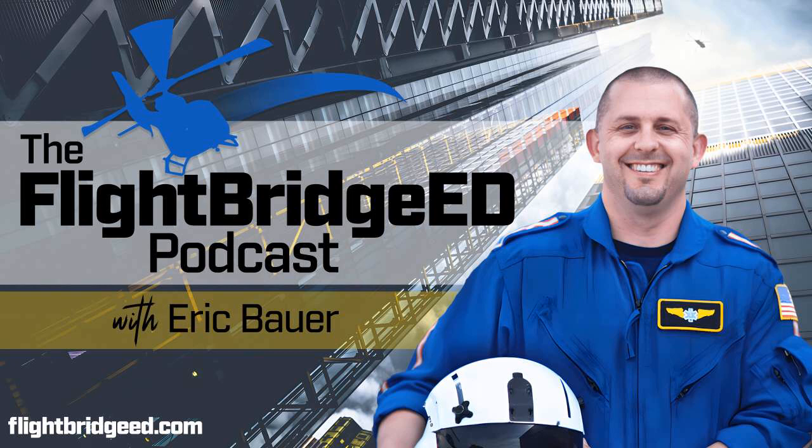So that's always something you document, right? That is what we kind of consider now as your true systolic blood pressure. Because out of any phase now, whether we're talking about your assisted systolic or your assisted aortic end diastolic pressure, or we're talking about your diastolic augmentation, that is now truly your highest pressure throughout every phase of the cardiac cycle. So we can kind of look at that as, now that is our true systolic blood pressure. But that's happening during diastole, and that's allowing for really, really good perfusion to those coronary arteries if timing is correct.